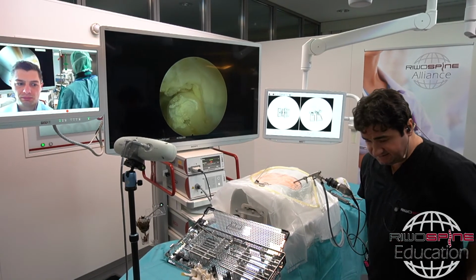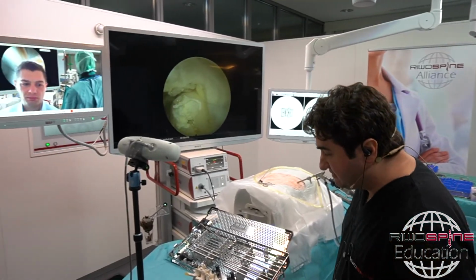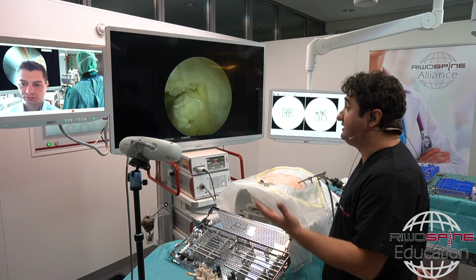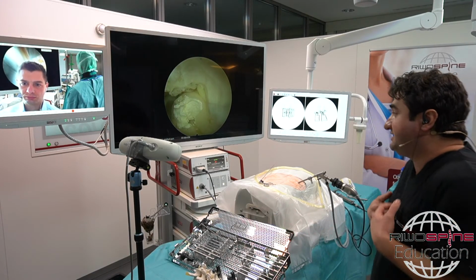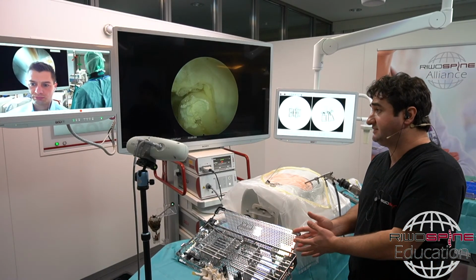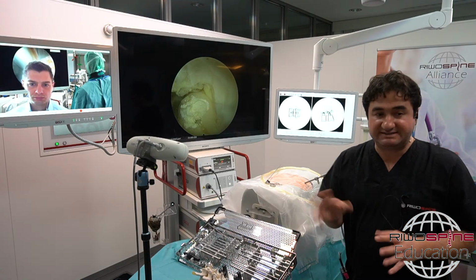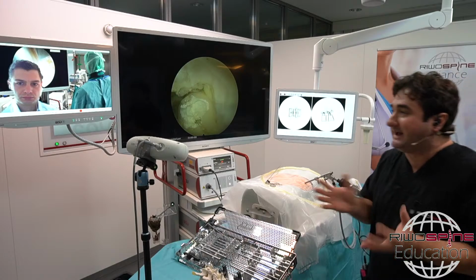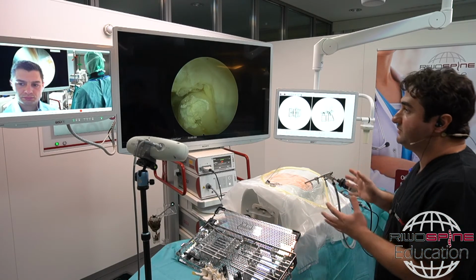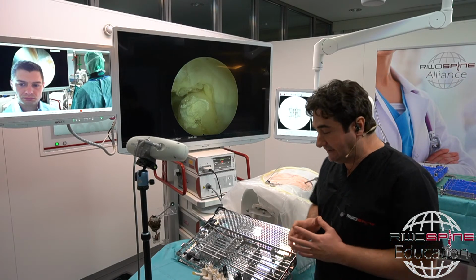Yeah, it's not easy to answer this, because it depends on where you learn or which philosophy you are following. I can share only my experience. In my daily practice, I don't use the radiological control too much, because I don't feel very comfortable doing resection under fluoroscopy blindly near the neural structures. That's why every time I prefer to use the tip control shaver if I want to do the bone resection.